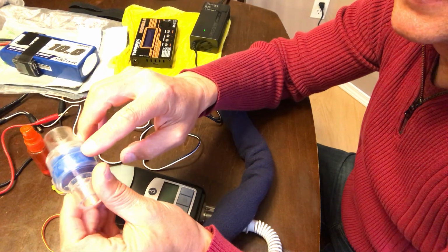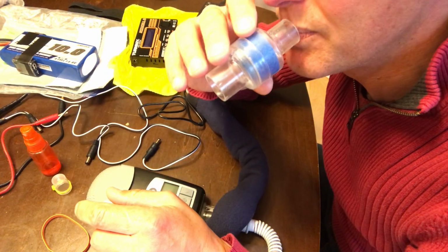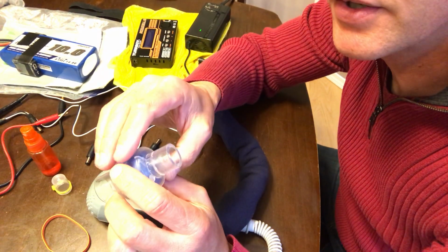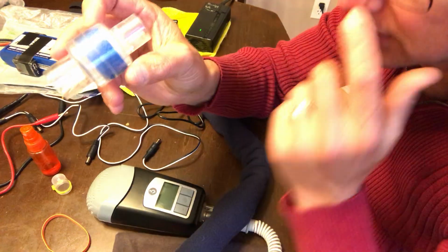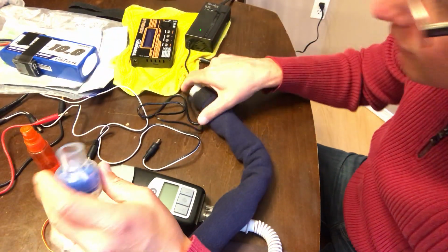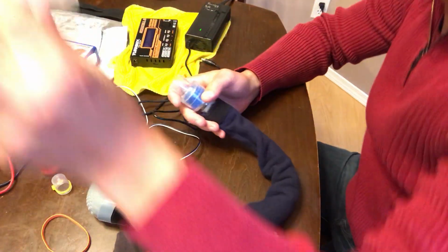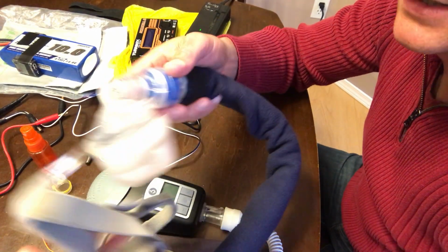It killed everything. And then before you use it, just rinse it again with water, and I blow through one end to get all the water out, and it just shoots all the water straight out. So I could just keep using this over and over, and it's a good little device. It helps keep moisture in the tube. So you'd want to hook that in, and then whatever mask system you have will just hook on there as well, and then you have your setup. So here's your complete setup.